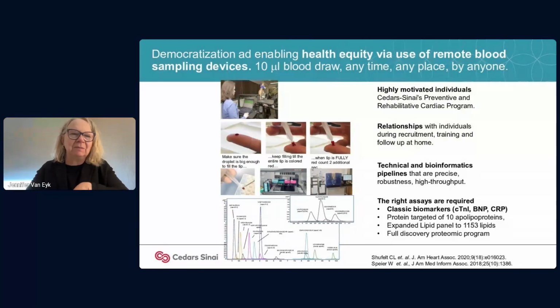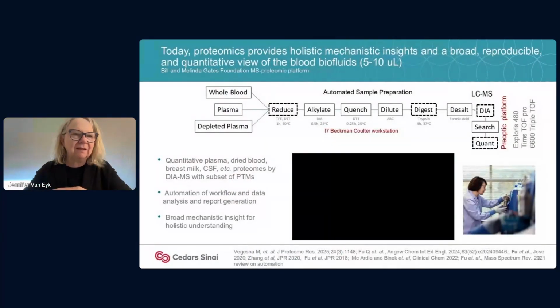And again, we're going to be measuring this against cardiac troponin I, BNP and CRP, as well as the PROs and the virtual Fitbit measurements. So we had, as I mentioned, already started to work on automation. Phil, do you want to just run the video so people can see it working, and then I'll talk about what we've done?